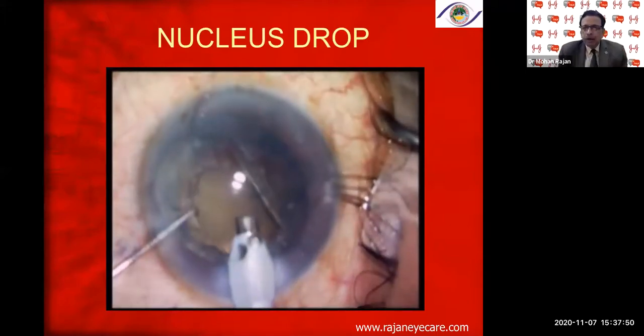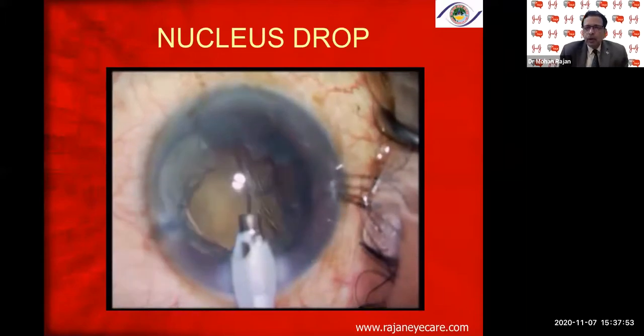And this is very important. If you try to chase this nucleus, then you are in trouble. Don't chase this nucleus, which goes into the vitreous cavity.